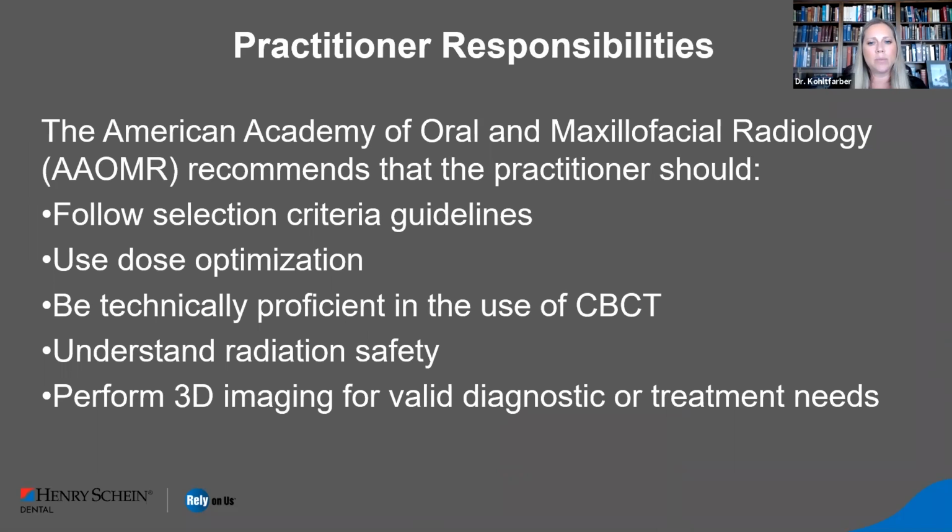So the American Academy of Oral and Maxillofacial Radiology recommends that the practitioner should follow selection criteria guidelines, which we're going to talk about today, use dose optimization, be technically proficient in the use of CBCT. What does that mean? It means to understand your machine, know all of the various presets that you have, and be able to either read your own CBCTs or know how to send those out.